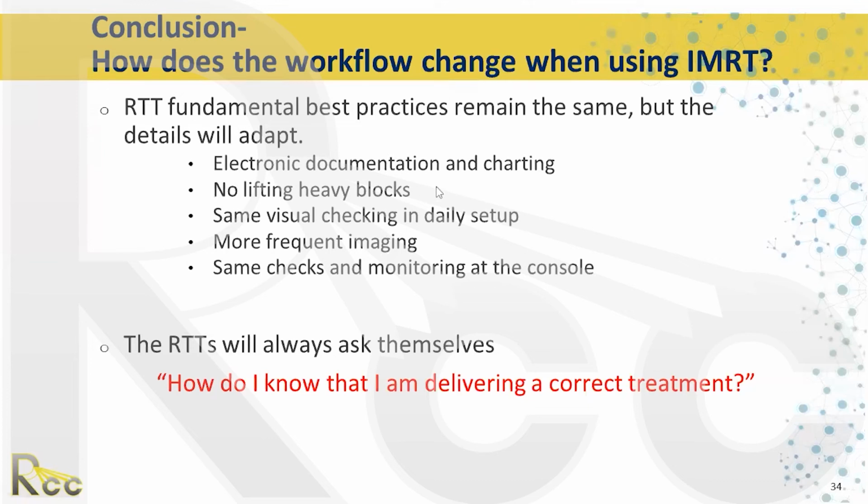We don't have to use heavy blocks with IMRT. The in-room part is a little bit different, but it is still, if not more critical, to make sure that your patient is set up correctly.